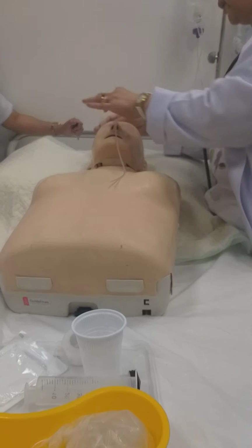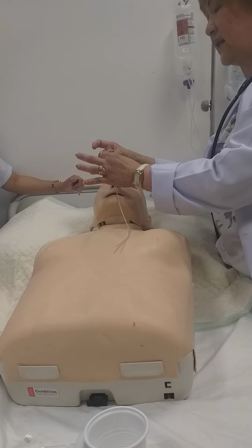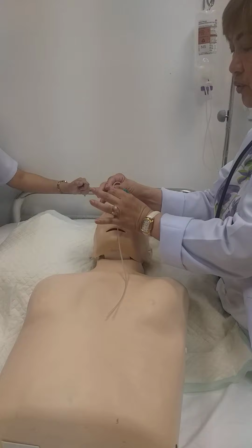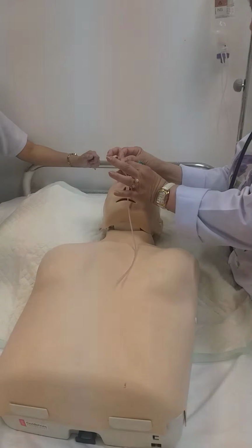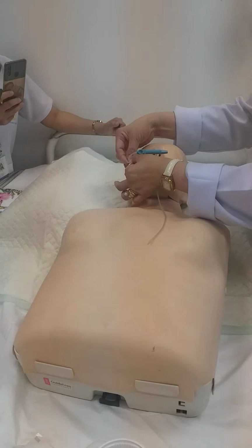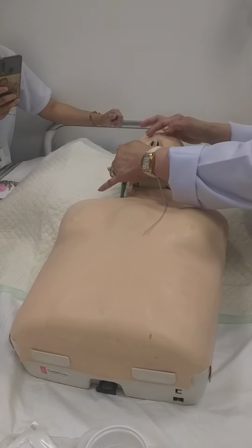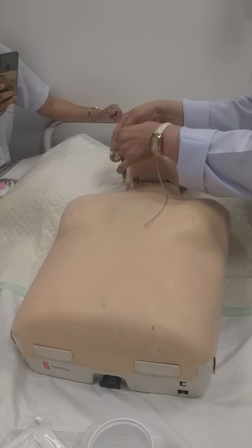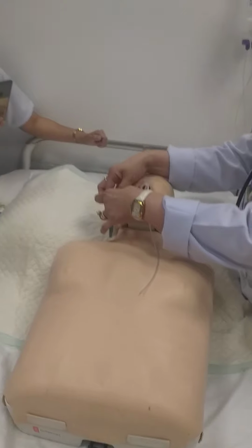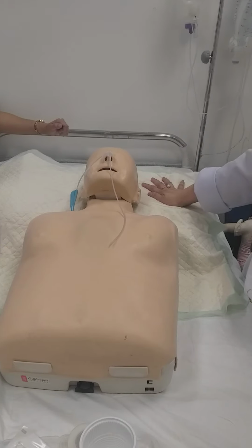So now, I will put this one, butterfly. Means to say, you have to keep it together like this. Okay? And put it down to the cheek of the patient. Not on the eye. So put it down a little bit here. Okay? So we're done.